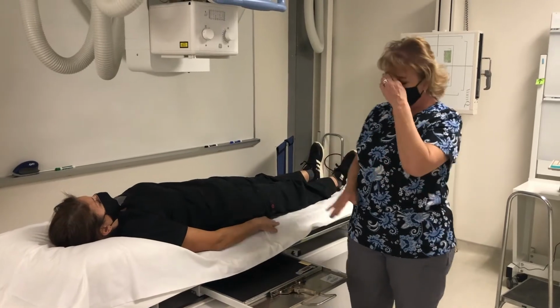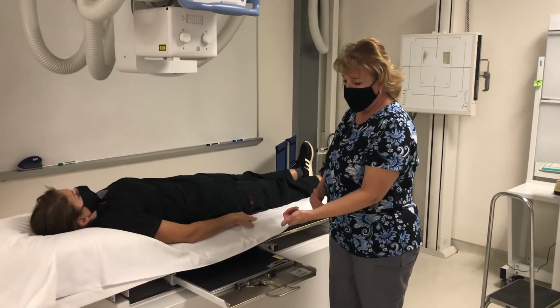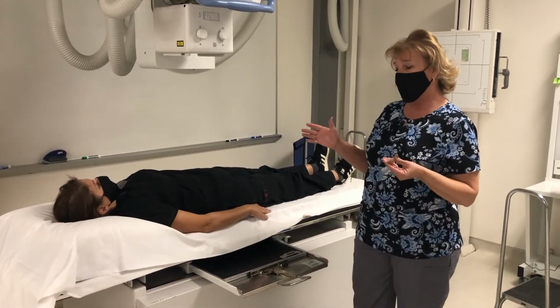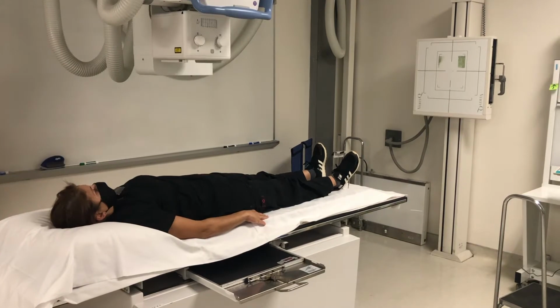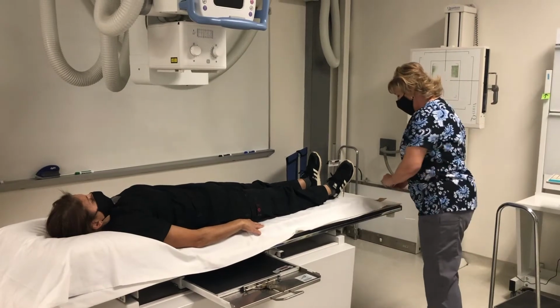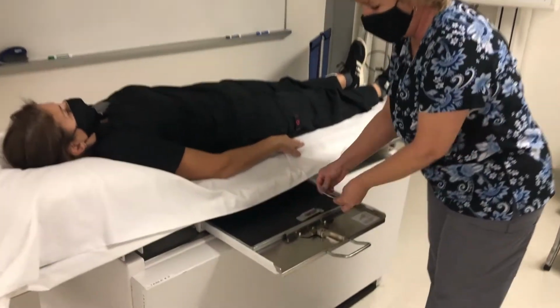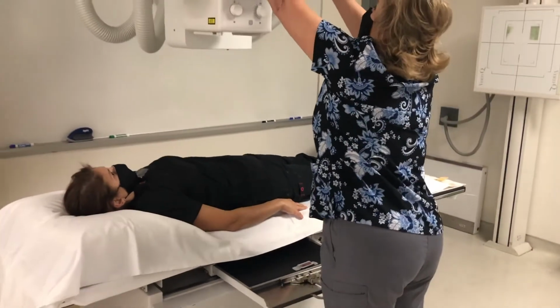So after giving her the injection, I would swap out my IR for probably another 14x17, but this is going to be collimated to 11x14 or 10x12, depending on the size of your patient. And this is going to be what's called a nephrogram. This is probably going to be at about 1 minute. So 1 or 2 minutes, I would put my right marker and whatever time it was, if it was a 1 minute or 2 minute time, on there.